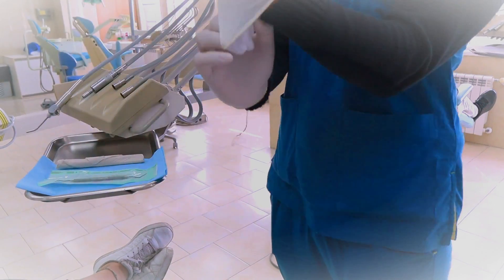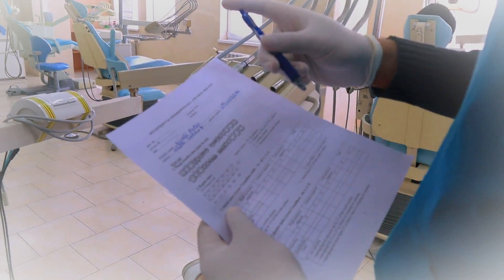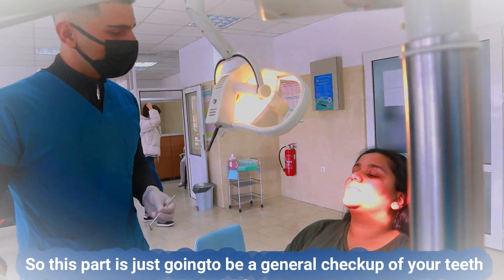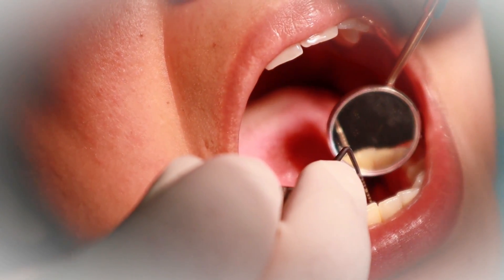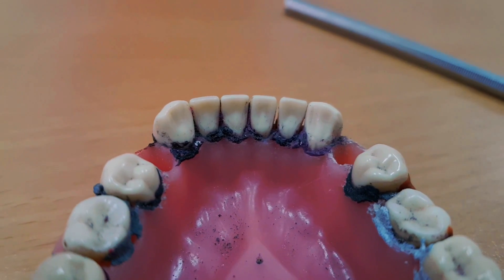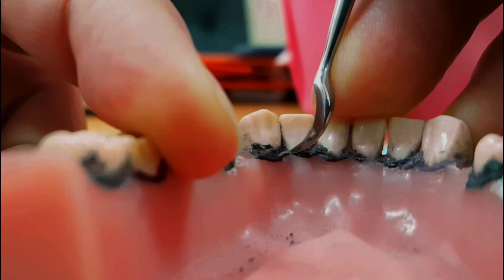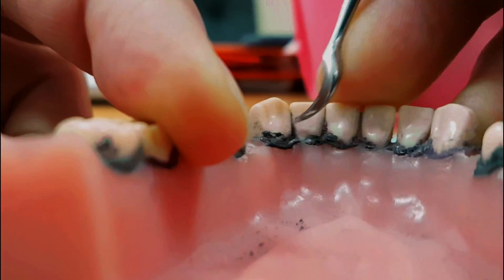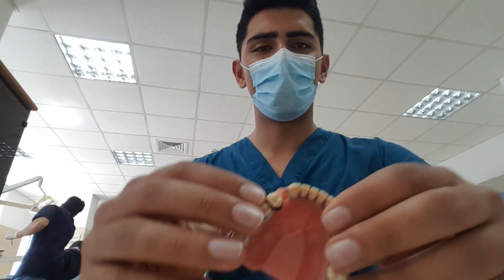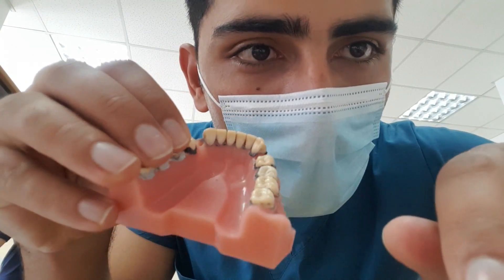So after she came in and we did the oral hygiene index last time, I knew exactly which teeth needed to be cleaned and which surfaces of the teeth needed to be cleaned. The main teeth in Nirali's case were the lingual surfaces of her mandibular central incisors. So the next lesson I got free, I picked up a practice model and started practicing before I worked on Nirali in real life. The purpose of this was to master my technique and I asked for some advice from my teacher, so I knew exactly what needed to be done in the next appointment and we didn't waste any time.